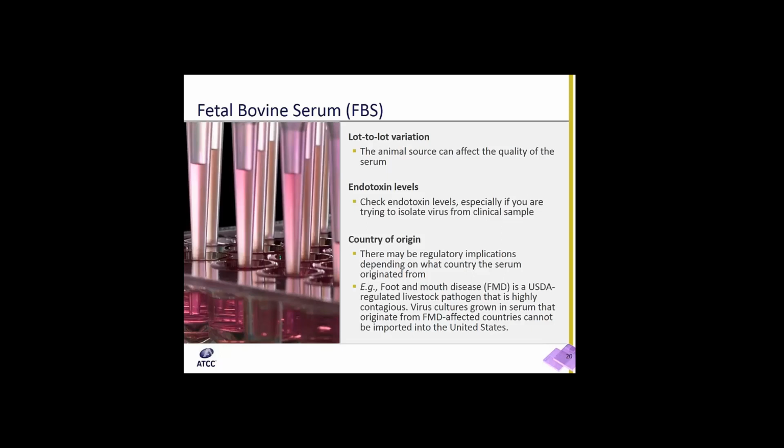Unfortunately, there is no test for the presence of this agent, and so we recommend that you essentially obtain all your bovine products, including sera, from countries that are not affected by BSE, so that this will help you for downstream use of the virus culture.